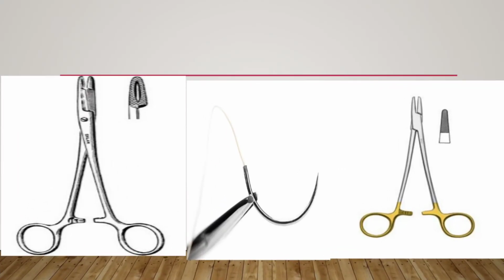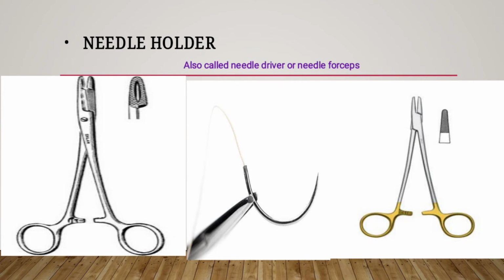Another instrument which is most commonly used in surgical practice is the needle holder. A needle holder is used to hold surgical needles while suturing or while ligating tissues or arteries. Needle holders are also known as needle drivers or needle forceps.